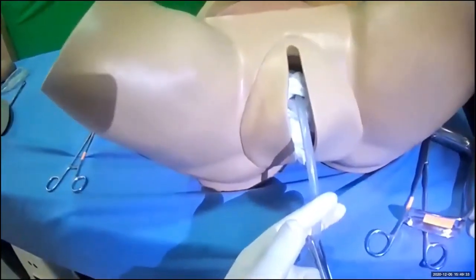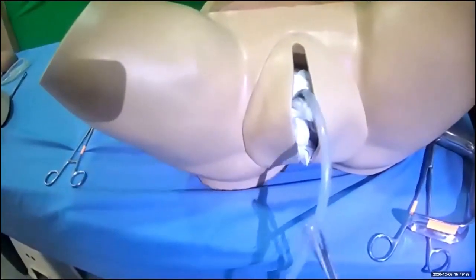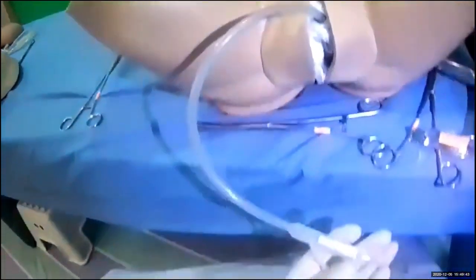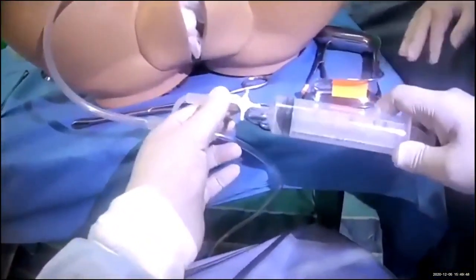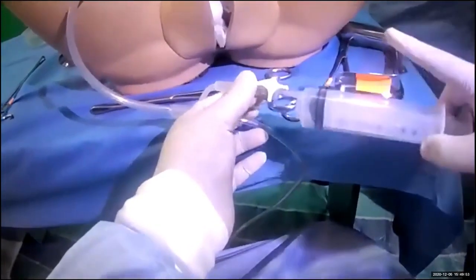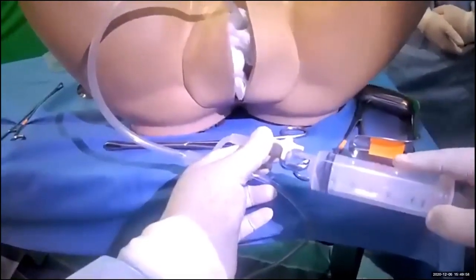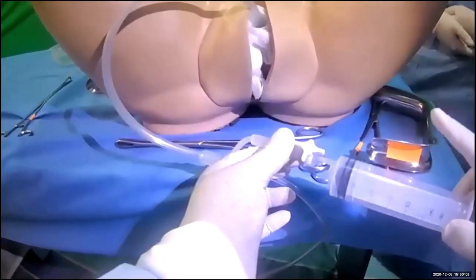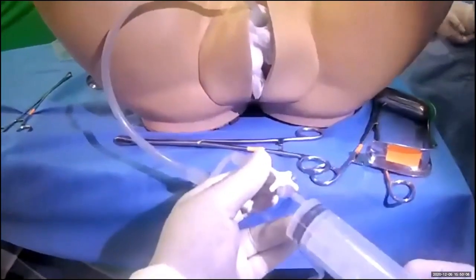Once you are happy that you have stopped the bleeding, you can deflate the balloon after 24 to 48 hours. Deflation is done in a slow, stepwise manner: deflate 50 cc first, then monitor for bleeding. If there is no bleeding, reduce another 50 cc, then another 50 cc, continuing until you have removed all fluid from the cavity. It is important to document the amount of fluid used throughout.